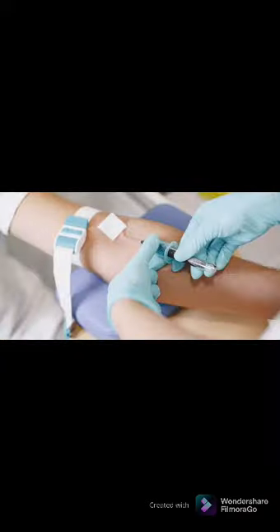Steps to follow for routine ETS procedures, or evacuated tube system procedure. Review and accession test requests. Approach, identify, and prepare patient. Verify diet restrictions and latex sensitivity. Sanitize hands. Position patient. Apply tourniquet and ask patient to make a fist. Select the vein, release the tourniquet, and ask patient to open the fist. Clean and air dry the site. Prepare equipment and put on gloves.